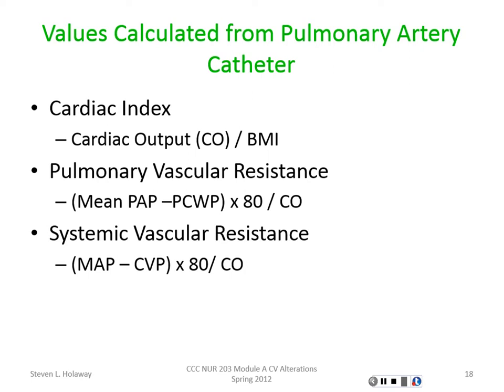You actually push the fluid through the blue port. CVP is the blue port. I'm sorry, did somebody have another question? The yellow port measures the PA pressure and the pulmonary artery capillary wedge pressure. Actually, I've got more slides on that, so we're going to go more specific into that. I promise you, we're going to go on. We're going to cover some. Whatever questions you have, I have it covered.